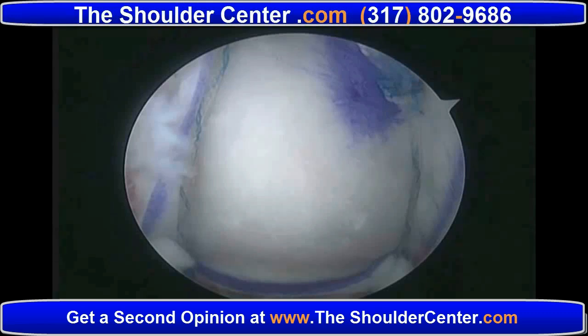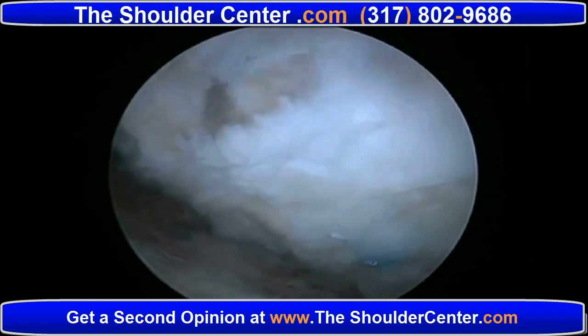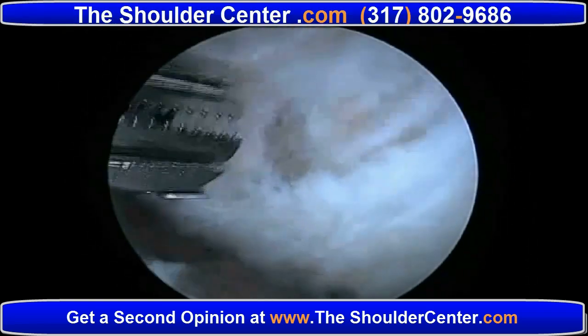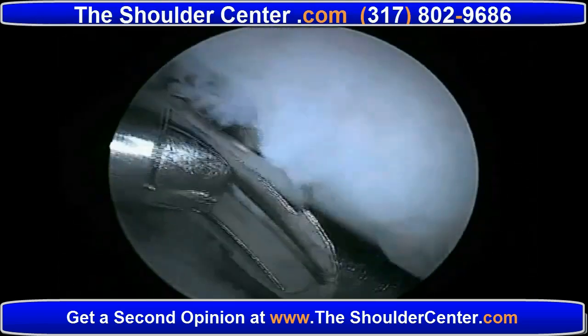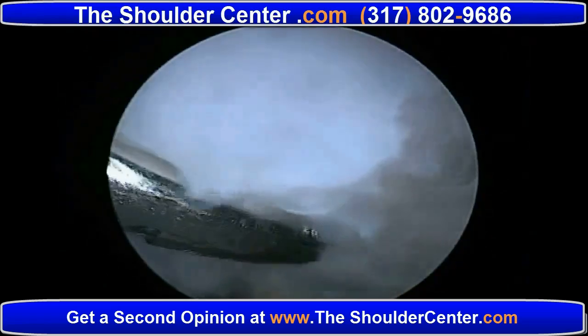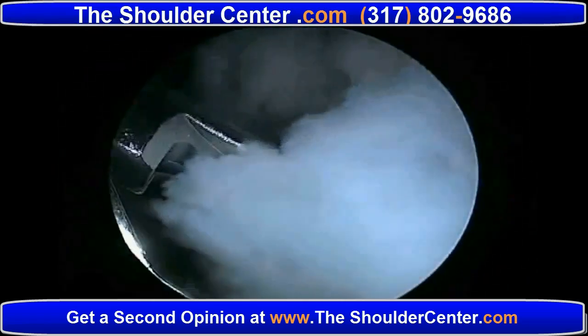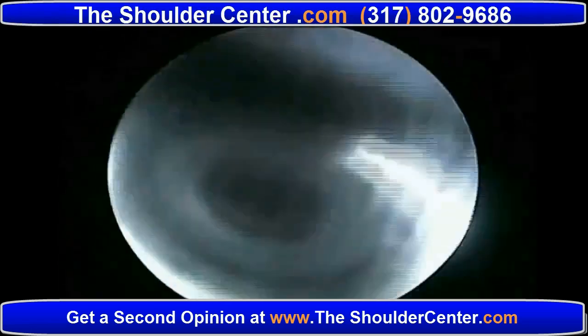Revision rotator cuff repair after healed reinforcement graft. We know that an initial benefit of reinforcement graft for complex tears is that it improves the healing rate. But a secondary benefit is for patients like this one that suffer a recurrent injury. This patient suffered a traumatic recurrent injury more than a year after repair of a complex rotator cuff tear with reinforcement graft.